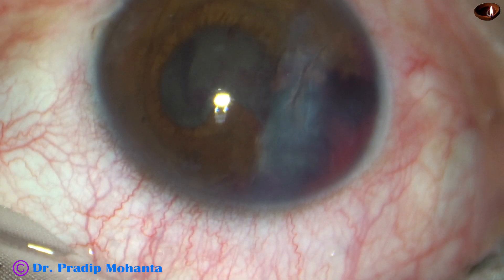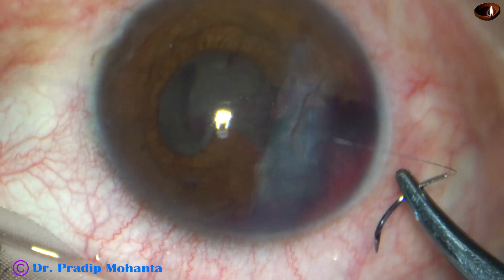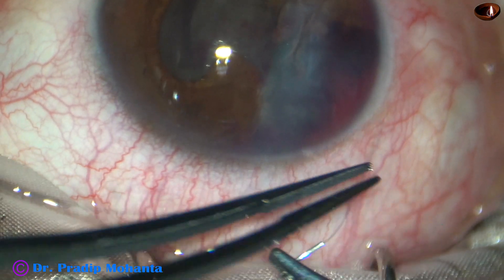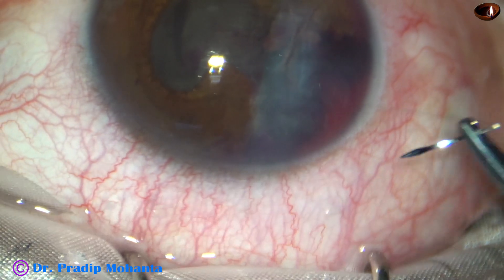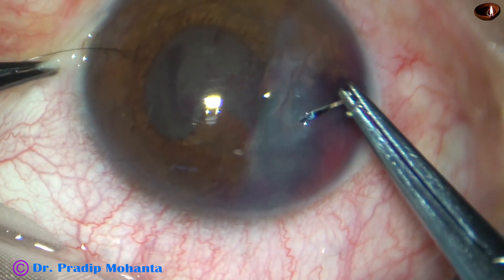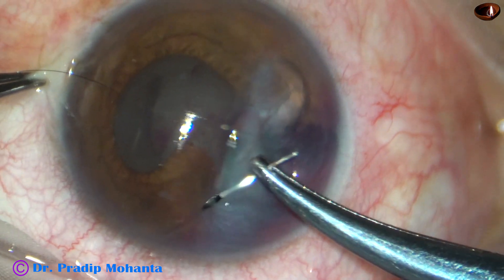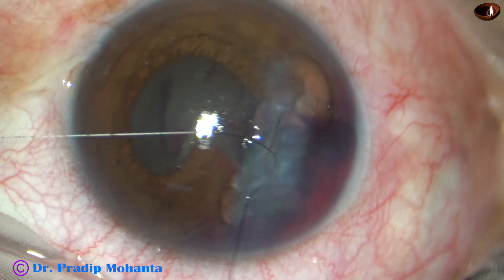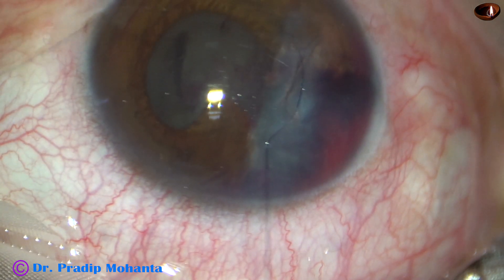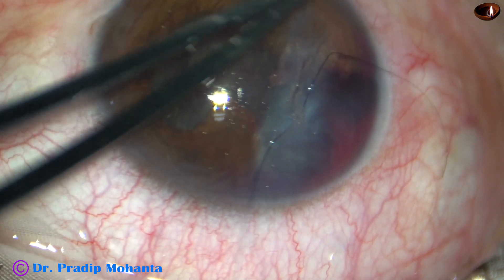And now this wound is to be repaired. I have asked for a new 10-O nylon. This is 10-O nylon from Orulab. It's a beautiful suture material. It causes no irritation of the tissue if the knot is buried into the cornea or sclera.